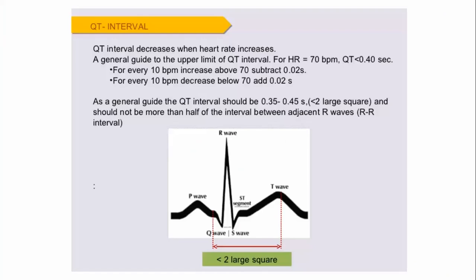Just a few extras that we'll throw in here for the final finale. QT interval. This is like, to me, one of the stepchildren. It's something we don't talk about as much as the general rhythms. I really doubt they're going to ask you to calculate a QT interval, and it's not on our competency exam, so don't worry about that. I just wanted to have a good minute or so discussion about this.